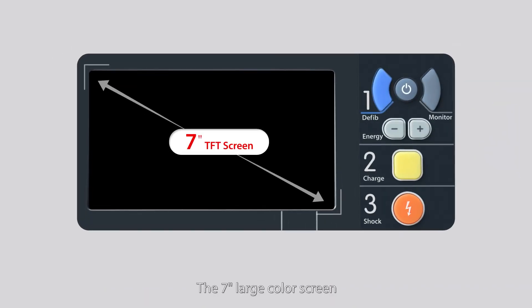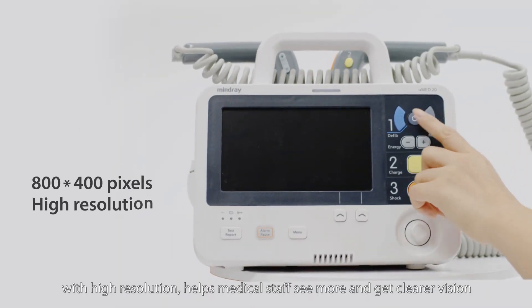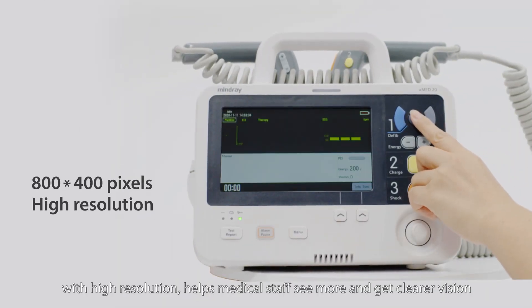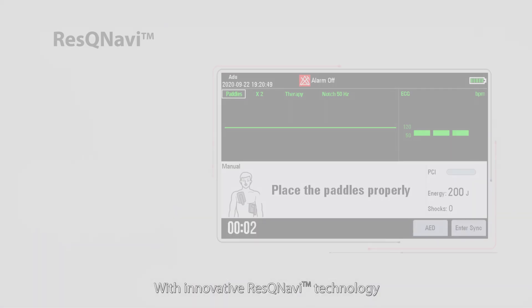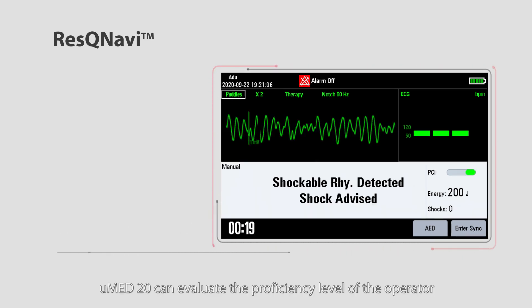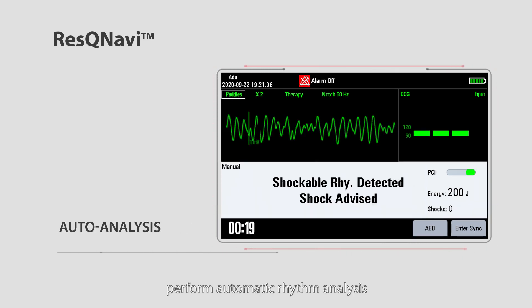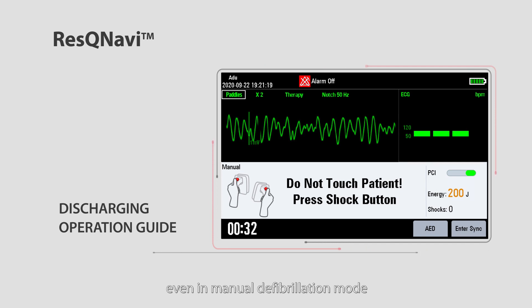The 7-inch large color screen with high resolution helps medical staff see more and get clearer vision. With innovative Rescue Navi technology, UMED20 can evaluate the proficiency level of the operator, perform automatic rhythm analysis, and intelligently navigate the rescue process step by step, even in manual defibrillation mode.